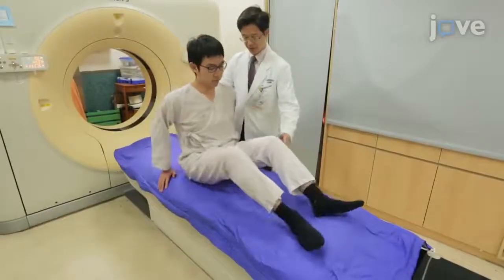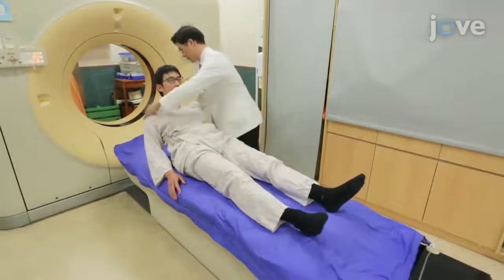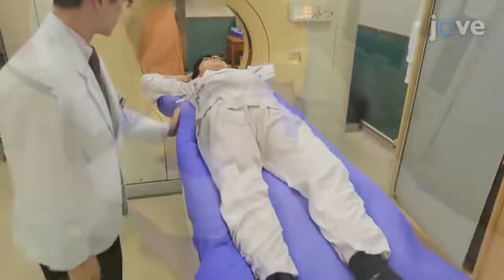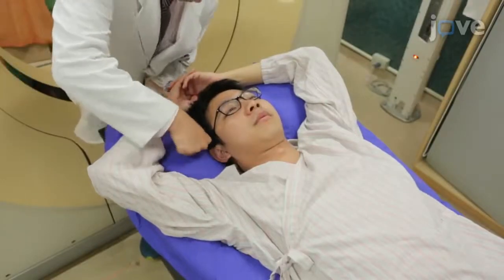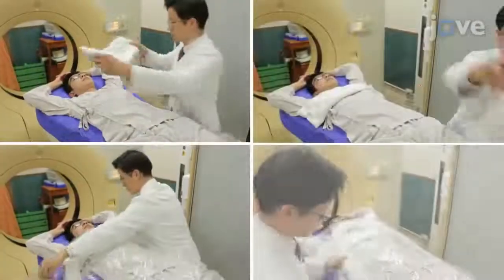To begin, place the patient in the supine position head first with the arms over the head, and secure the patient onto the couch. Make a personalized evacuated vacuum bag according to the patient's position and body shape, and cover the patient with a cover sheet.